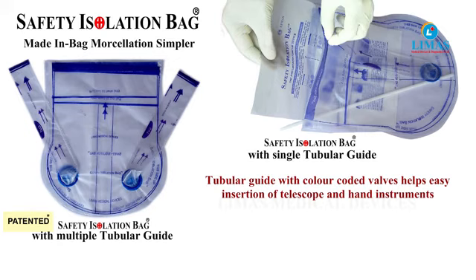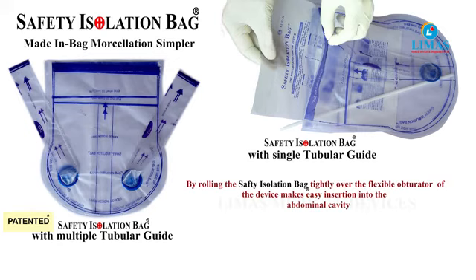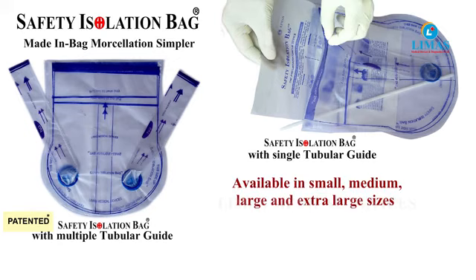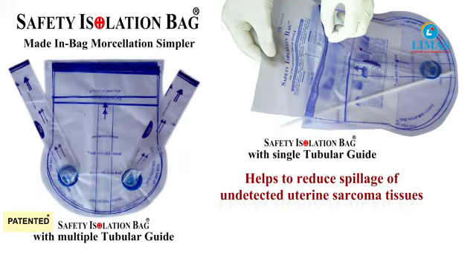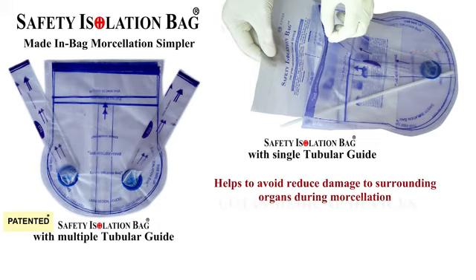The safety isolation bags make in-bag morcellation easy and simpler. The flexible introducer, the tubular guide, and the colored valves of the device make the procedure steps simple. It also prevents the twisting of the device.